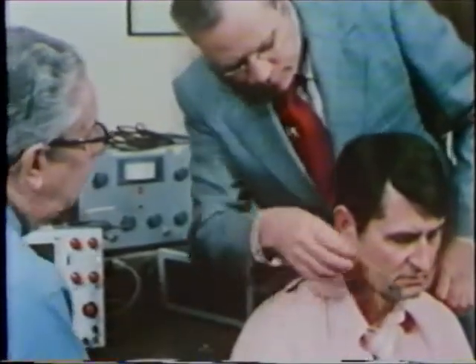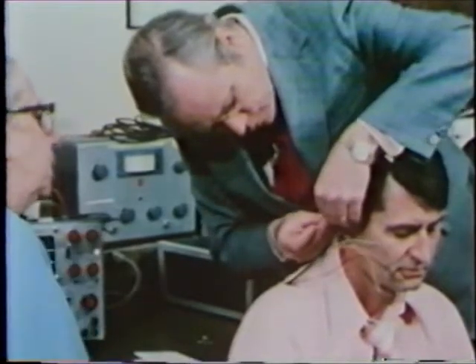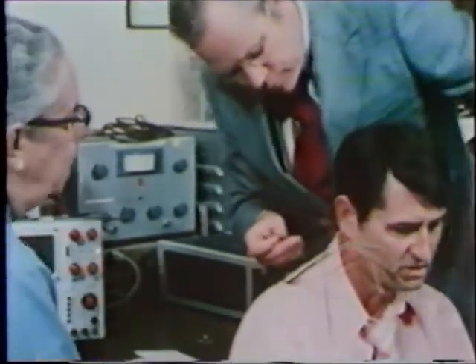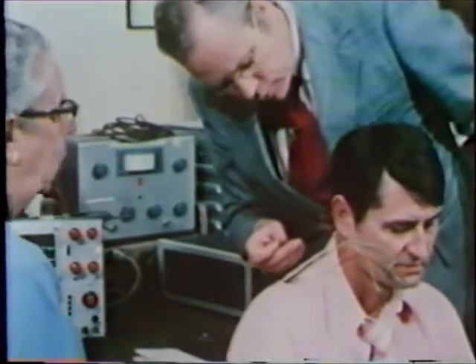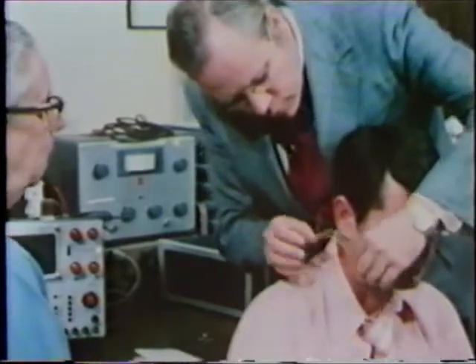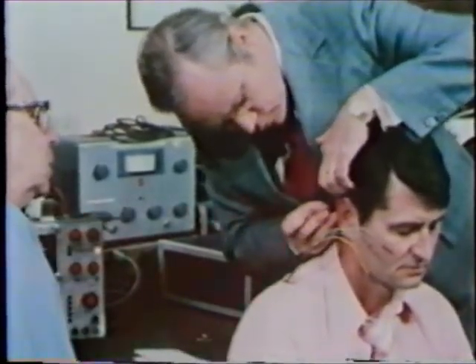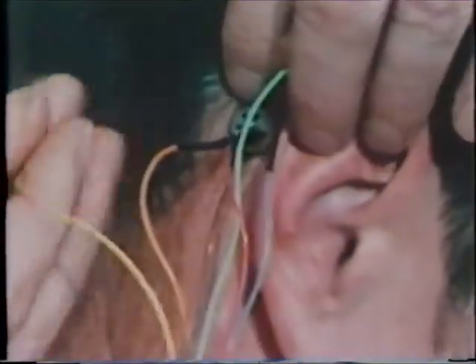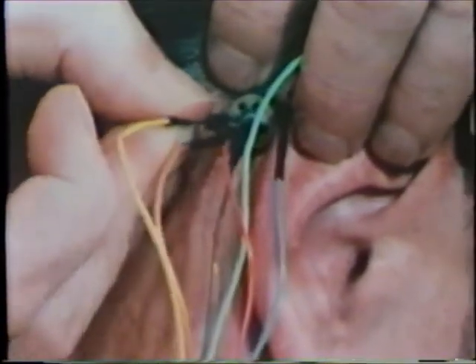Red is number two. In July 1970, we began systematic exploration of the sound sensations produced by electronic signals. We had no knowledge of what these responses would be, and we had no preconceived theories as to which electronic signals would be best. We had simply designed a system to give maximum flexibility of signal stimulus and had the possibility of stimulating 1 to 5 different parts of the cochlea.